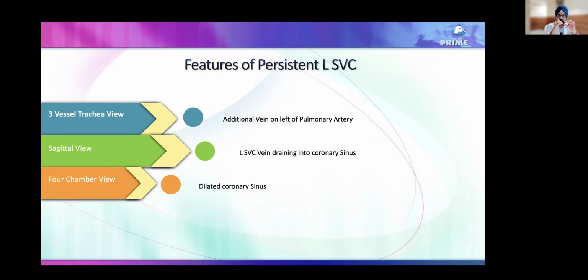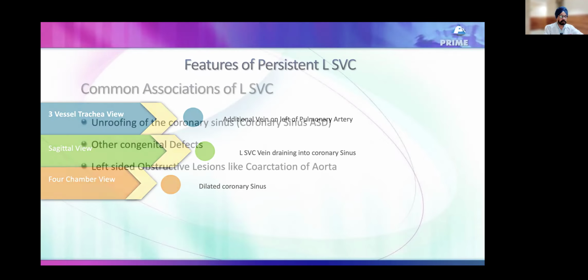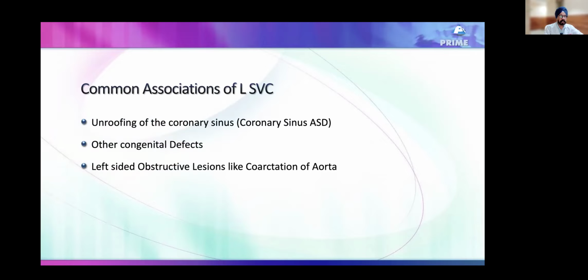When we are talking about arrhythmias, many a time we take the SVC and aorta flow to diagnose arrhythmia: aorta for systolic timing and SVC for atrial. So they are both lying together. Ascending aorta, descending aorta, left superior vena cava, ascending aorta is the normal. And then you get a dilated coronary sinus because it has to get dilated.